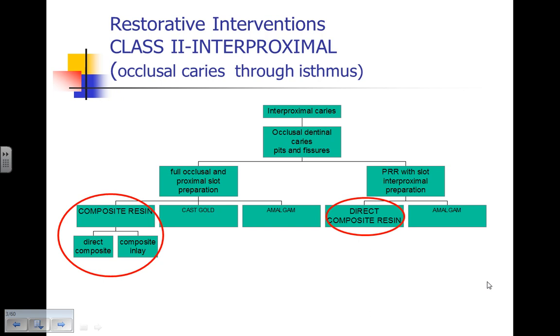We see the replacement rate of Class 2s being 3.5 times greater than that for amalgam. And certainly the placement of the light and light curing becomes very critical in terms of the duration of light curing.